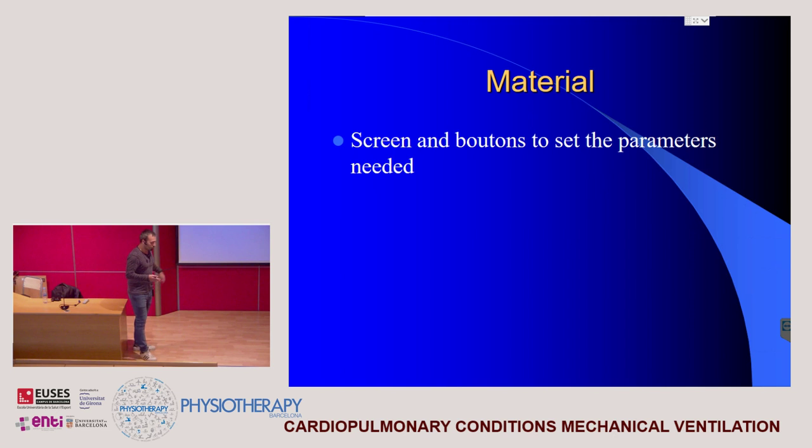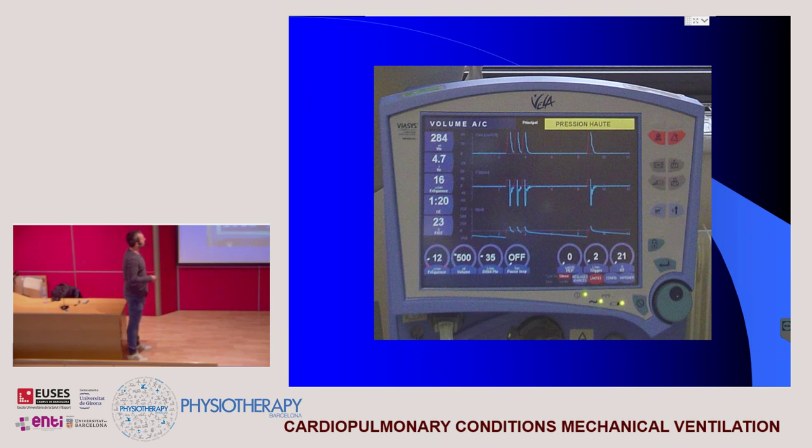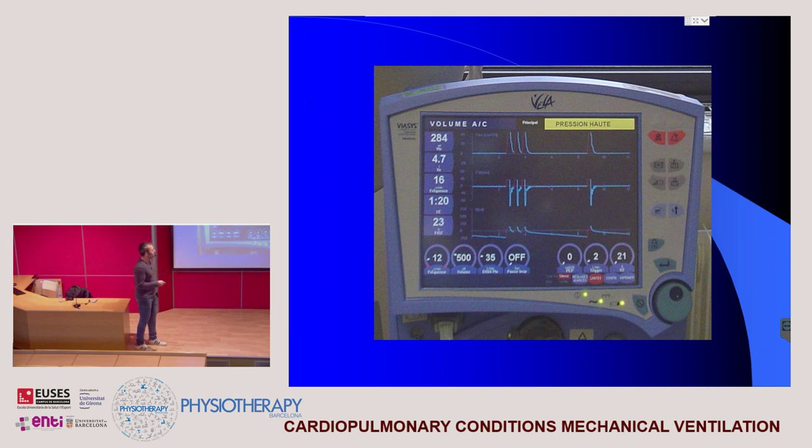But if we have to separate how the air arrives to the patient, you have to know each part of the air's travel. First, we have a screen with buttons, where we always look at the parameters the patient is performing, and also the parameters set by the chest physicians or intensivists.